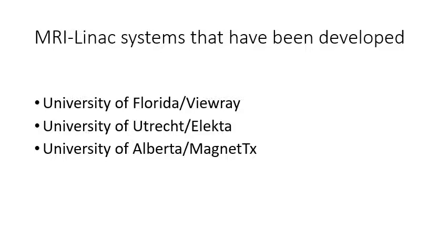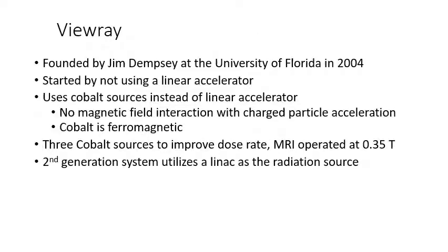Three types of MRI Linac systems have been developed with the intention of creating a commercially available system. They were by the University of Florida, the University of Utrecht, and the University of Alberta. ViewRay is a company formed at the University of Florida.